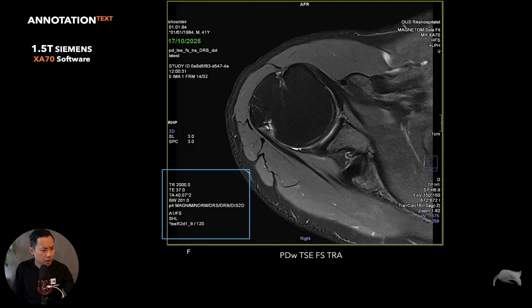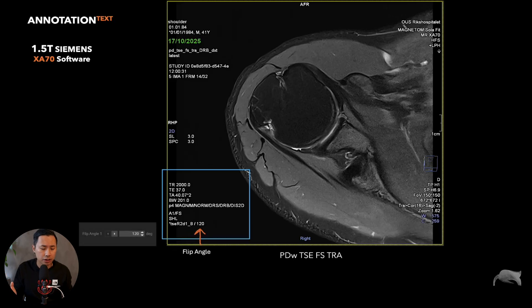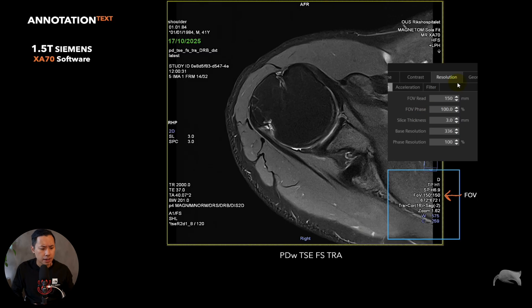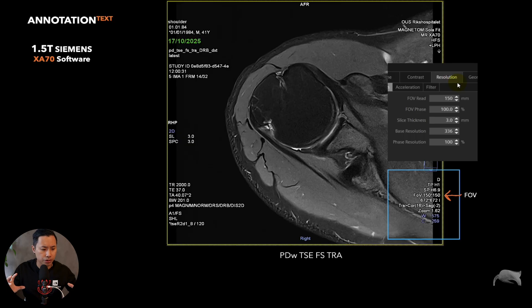The flip angle was 120 degrees, as you can see here. Now let's go to the next corner, which has to do with resolution.